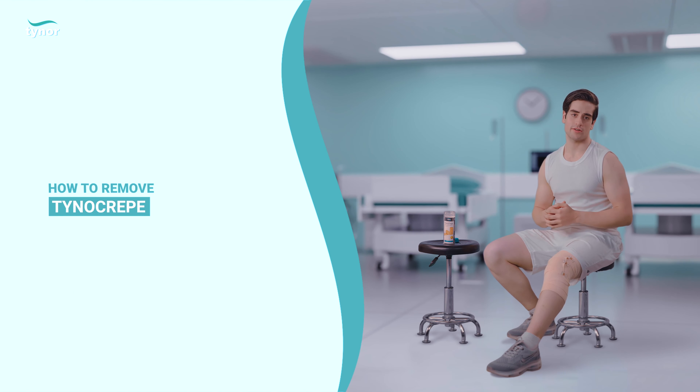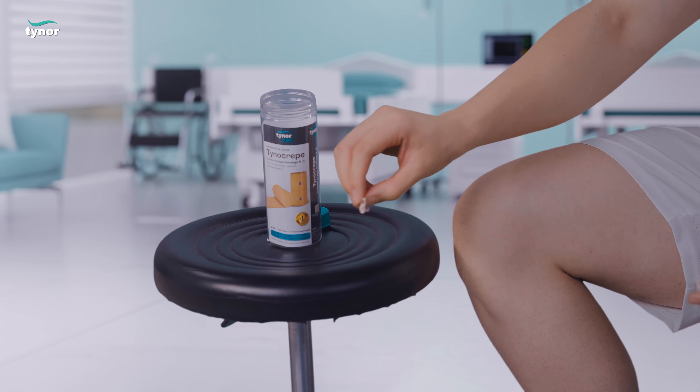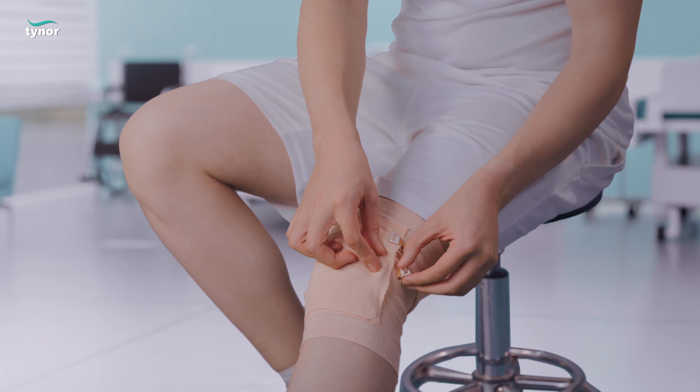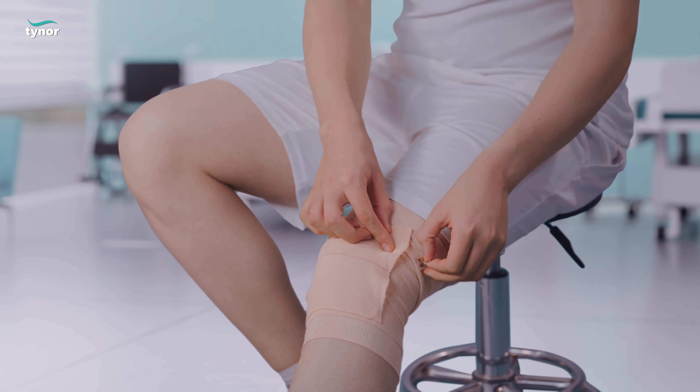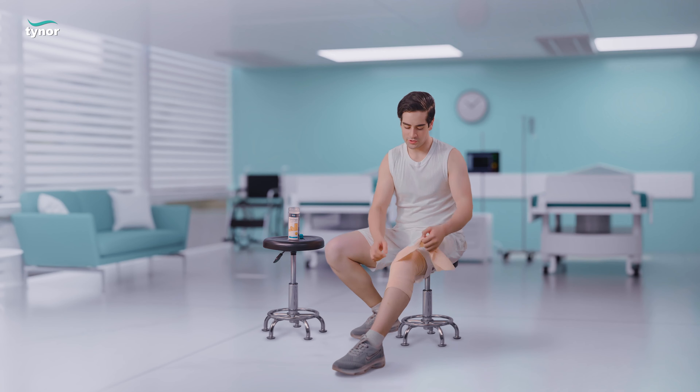The bandage can be worn at different injured areas like wrist, arm, etc. Now let me show you how to remove the product. Gently remove the elastic pin and slowly unwrap the bandage.